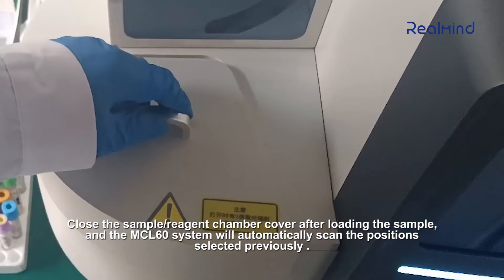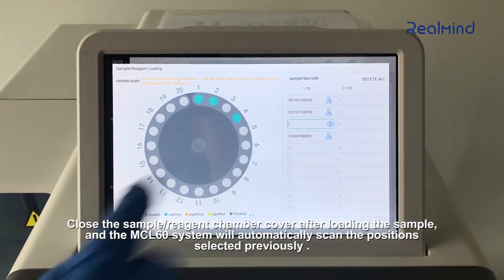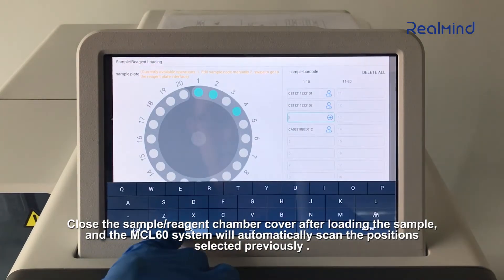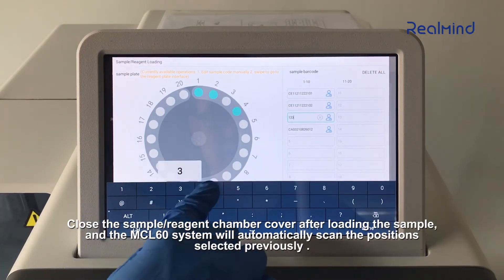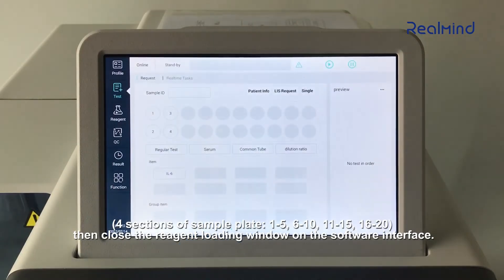Close the sample reagent chamber cover after loading the sample. The MCL-60 system will automatically scan the positions selected previously. Then close the reagent loading window on the software interface.